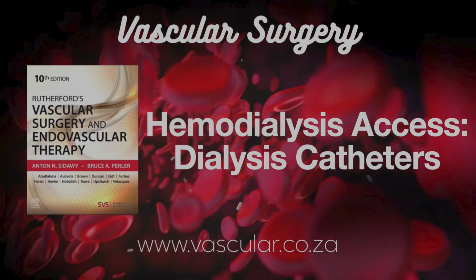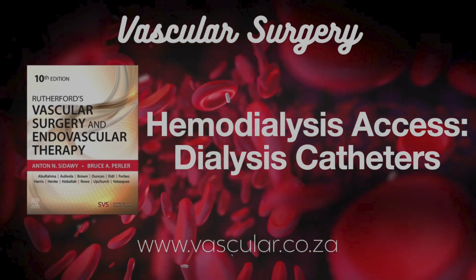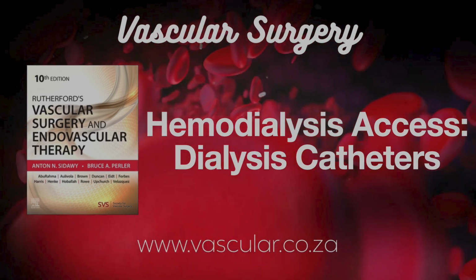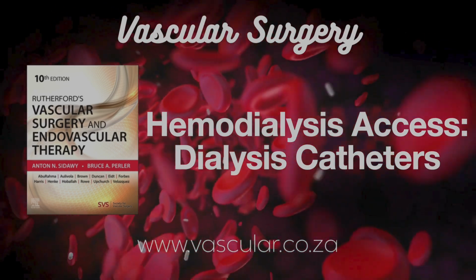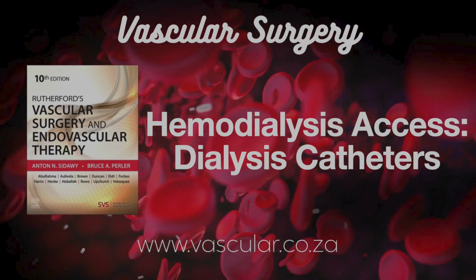Like what? Well, one rare but serious one is air embolism. Can happen late, too. How can it happen later? Air gets in maybe before tubing is connected, or if it disconnects, or through tiny cracks in the catheter hub, or even through the skin tract after removal if it hasn't sealed. So patient education is key.